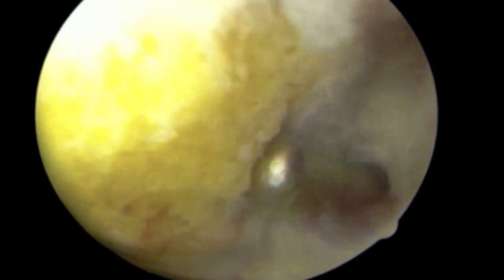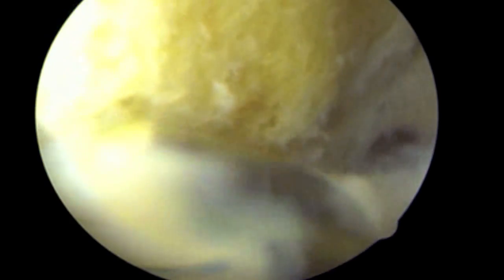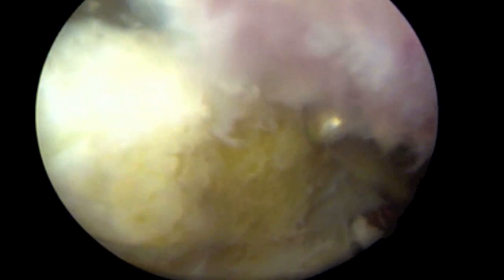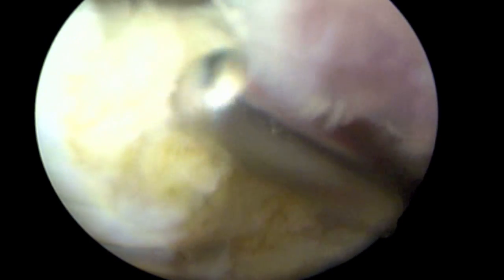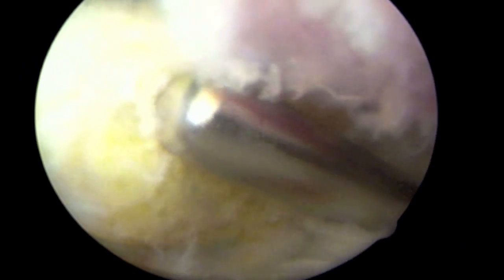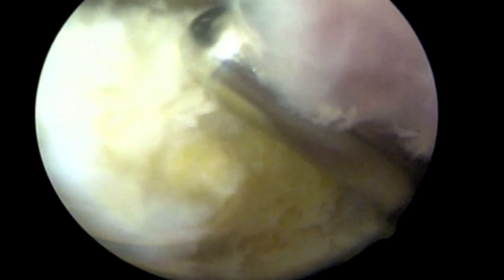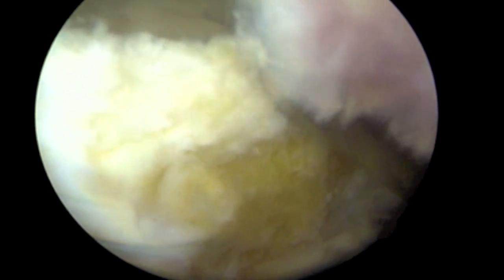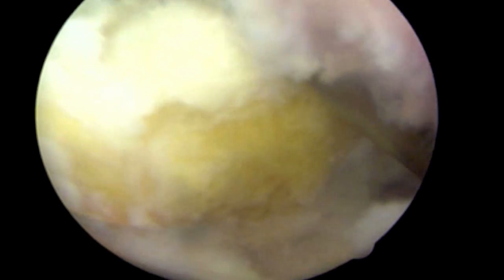The course of freeing up the bone includes removal of the soft tissues around the fragment itself. Once this has been done adequately, a grasper is used to then remove the entire bone fragment. The patient is currently in traction in order to allow for visualization of the hip joint and to perform this work.